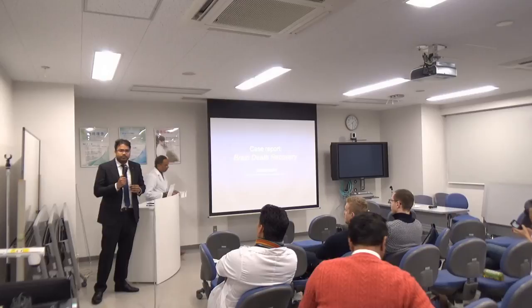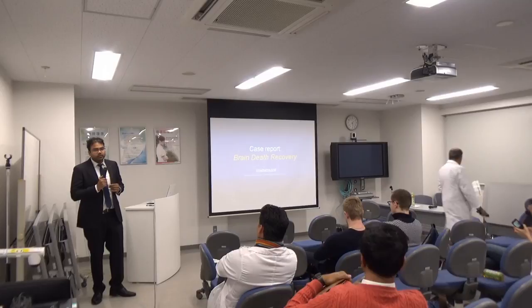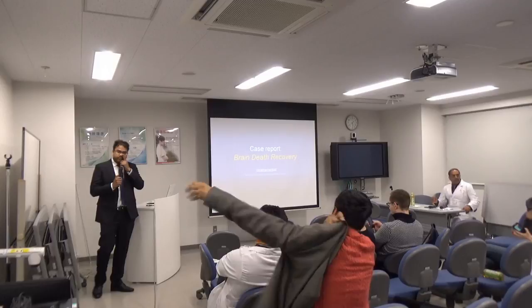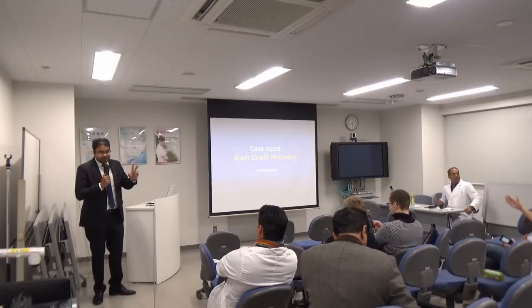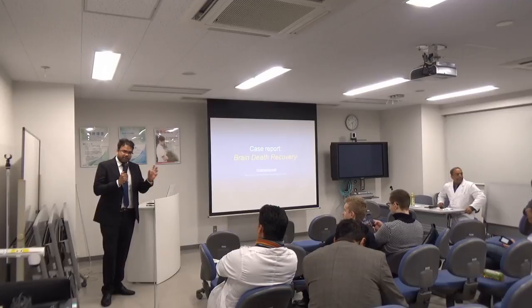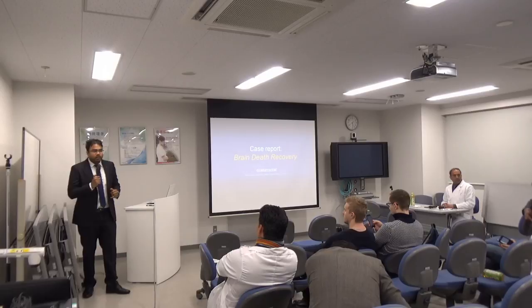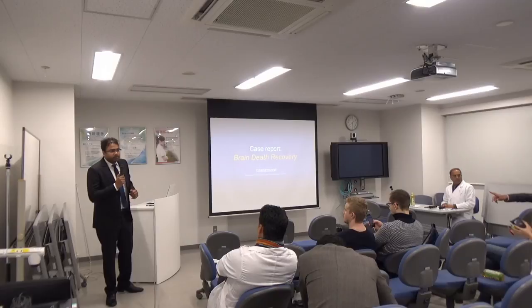How did you get to know that the change was only at the facet joints? Did you do anything else? Are you looking at grade 1 listhesis on an X-ray, or on an MRI? Is there a dynamic MRI that you are looking at? Yeah, I showed the dynamic MRI. So the distinction of this disease is based on a dynamic MRI. In a flexion scan, you see a soft tissue component, but in extension, it's completely normal. This points towards instability. The whole treatment is based on the dynamic scans, MRI and CT. In four out of five patients, we have stabilized the C1-C2 joints because it was visible.